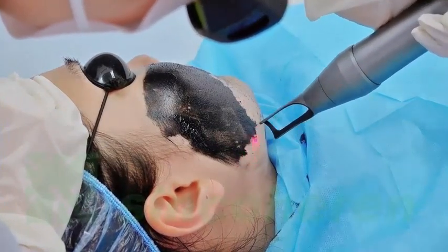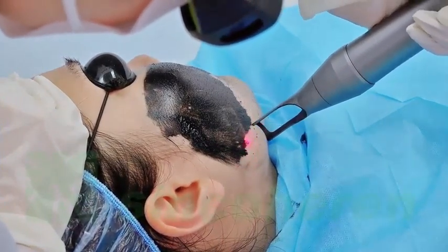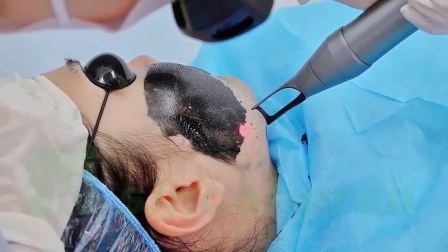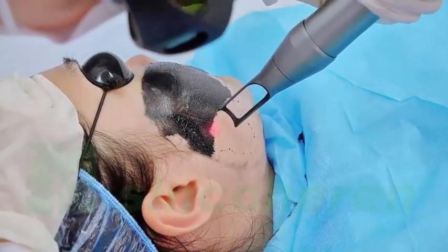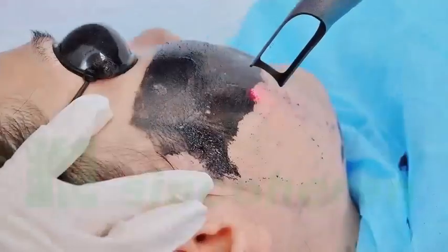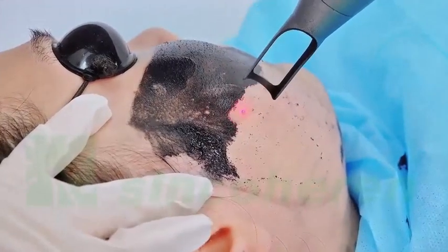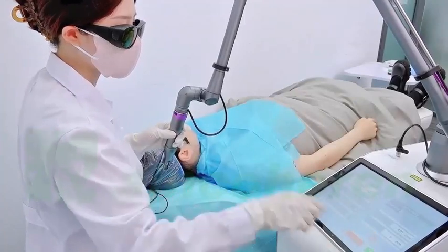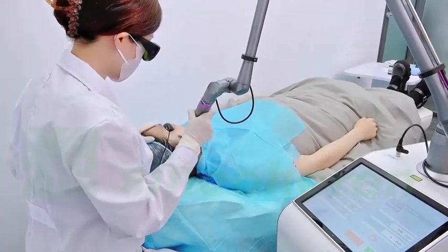The order is from inside to outside, from bottom to top. Place the cotton 2 to 3 times. The skin is slightly red and warm. Another hand helps flatten the wrinkles on the skin, such as deep wrinkles. The doctor should keep communicating with the patient to adjust the energy.